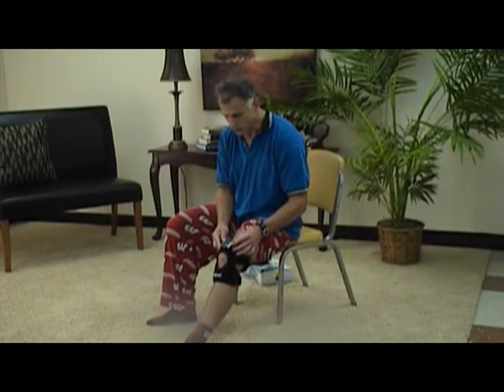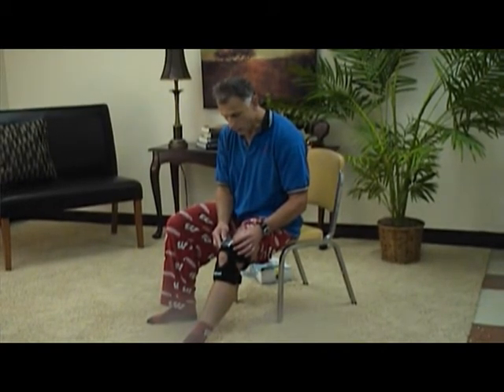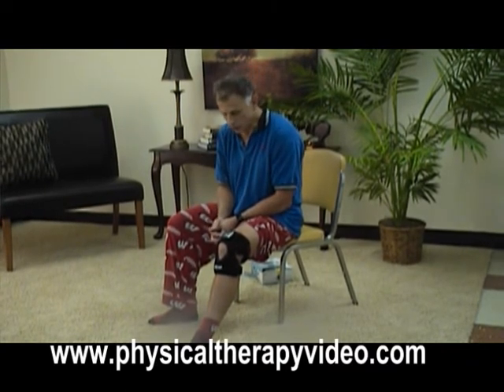What you'll do is put this on, and right now I'm acclimated to it a little bit, so I'm going to increase the intensity a little bit. There we go. Once you get it to the right intensity, you just leave it on, put your pant leg over it, and carry on through the day. You don't want to leave it on for typically more than a half hour. What happens is your body acclimates to it and it's not as effective. So a half hour is all you'd use it for. Then you just turn it off, and later in the day, you can turn it on again for another half hour.